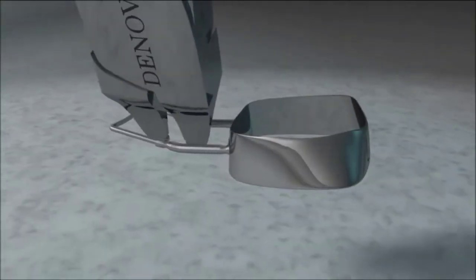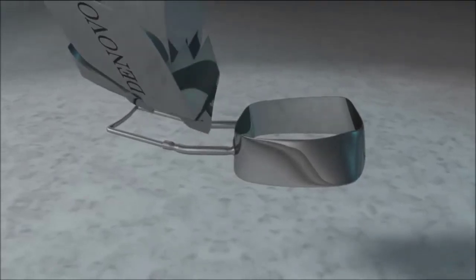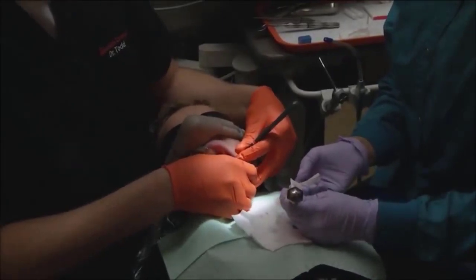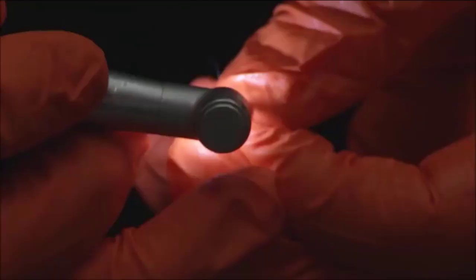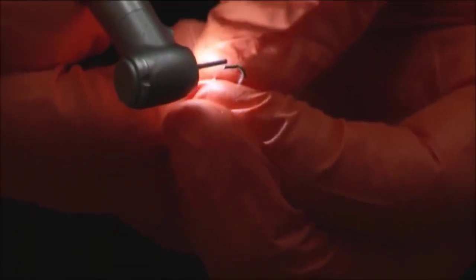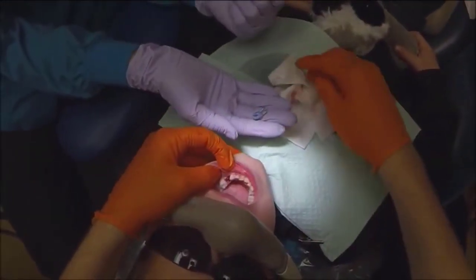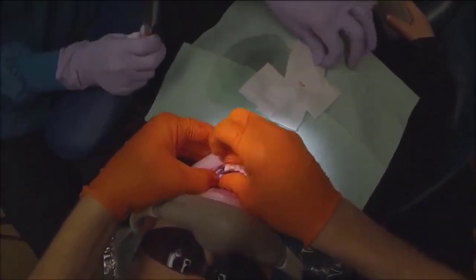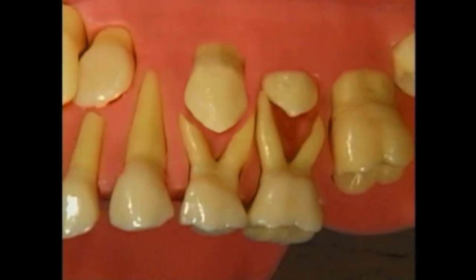To put a curve into the wires before cementing, use the De Novo three-jaw plier. If the band needs slight expansion to sit flush, insert the tube crimping plier between the band and the wire and open the plier carefully, taking care not to expand too far. After adjusting the wire and before cementing, check the wire for any sharp edges and shave them down with a football diamond burr or white stone. The De Novo chairside space maintainer is then ready to cement to the tooth using any glass ionomer cement.